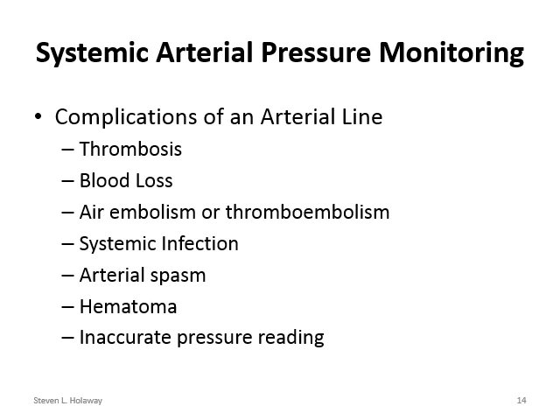I have seen one of the stopcocks turned the wrong way and the patient losing blood because the nurse did not turn the stopcock properly. You can get an air embolism or a thromboembolism. An air embolism is when, again, a stopcock is not turned correctly and you allow air into the system. Also, if you let the pressure bag go empty, you can get an air embolism from that.